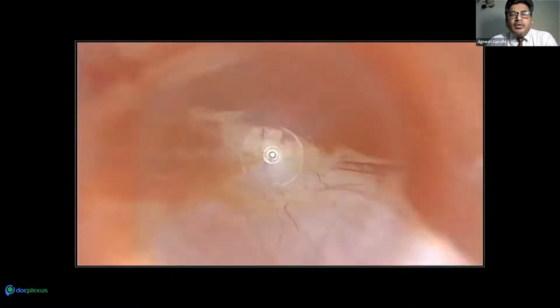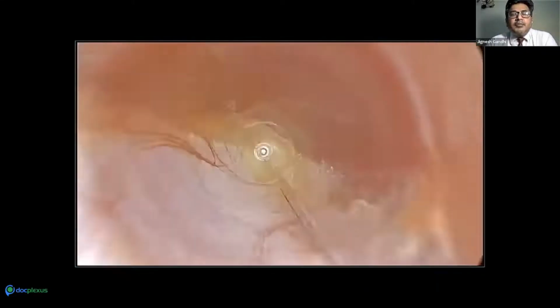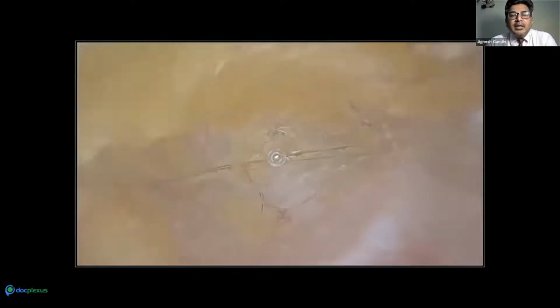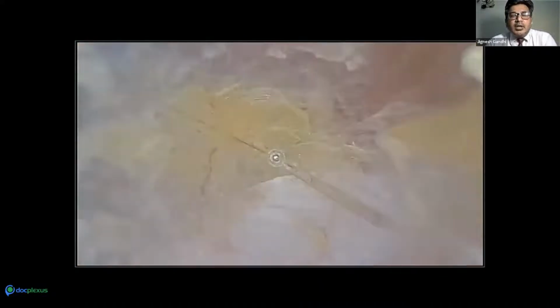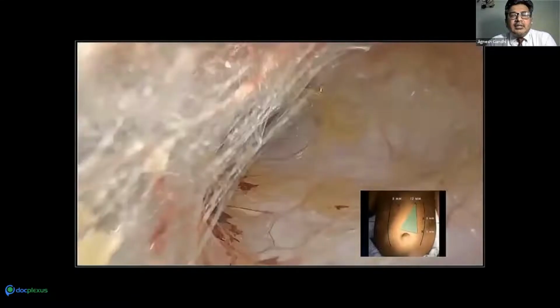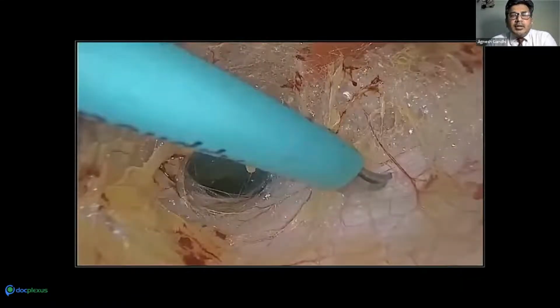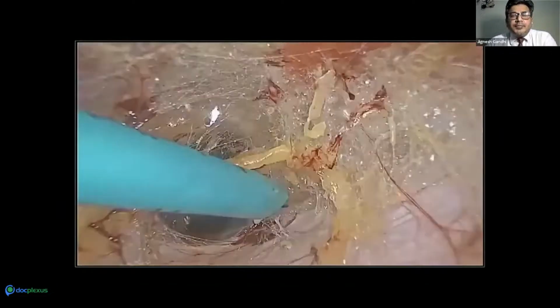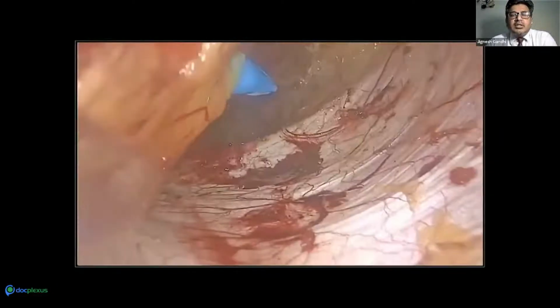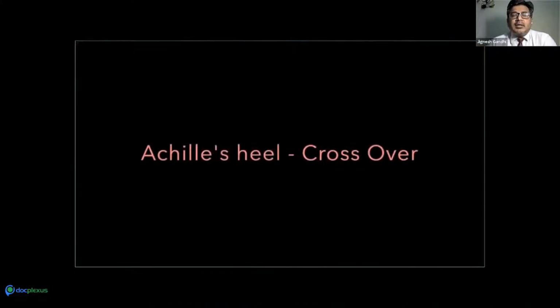The sharp edge of the trocar helps me dissect, and I can almost tell you that my half of the rectus sheath on the opposite left side is always dissected with this. So you can beautifully see here, you can get a nice fluffy plane there, and you can dissect this as much as possible. Then the next port comes in, and once you have the next port coming in, you do the further dissection with the help of scissors, and you clean up to reach the summit. This is my third port coming in now. You can see the entire space come up.